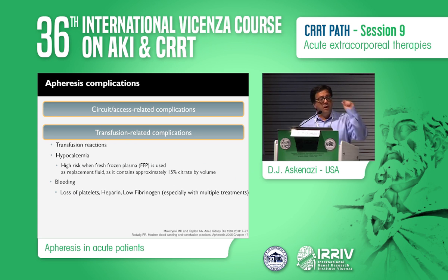Transfusion reactions: it's really critical when you're performing plasmapheresis to know that you have a very high risk for hypocalcemia. One of the reasons is that plasma, when it comes to you, isn't clotted off because there's a lot of citrate in it. By volume, it makes up maybe 15% of the bag. So it's a very, very high concentration of citrate, and you just have to recognize that as you're performing your therapy. You give calcium to the patient during these procedures, especially when you're using FFP, and it's extremely important that you're mindful of that.